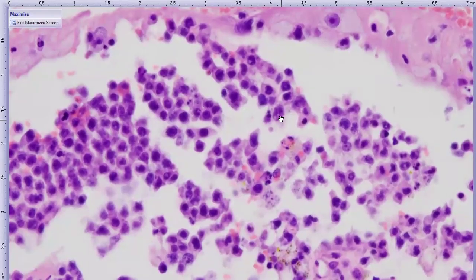I diagnosed this as lymphoma. I suggested that this could be vitreoretinal lymphoma, which is a very rare form of lymphoma that we see in Coplow. I suggested IHC, which turned into quite the debacle because the first set of IHC stains, so I suggested a CD3 and a CD20.